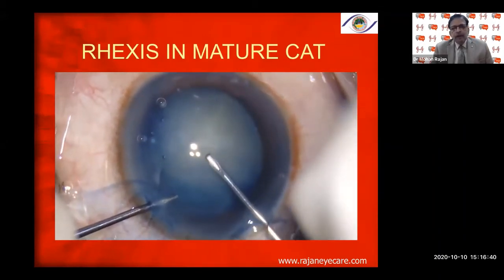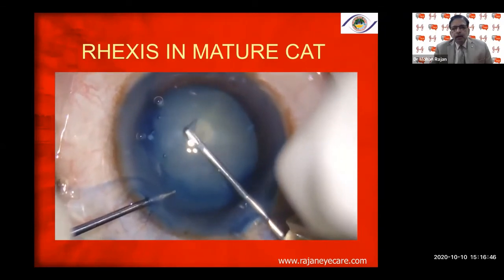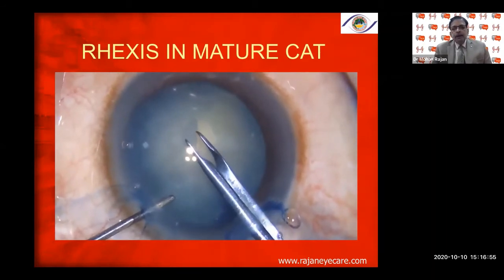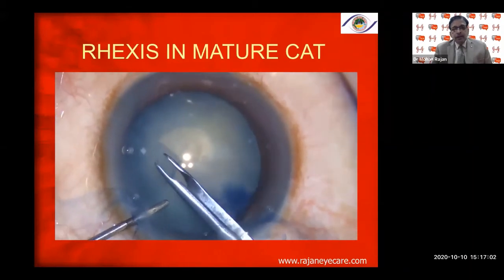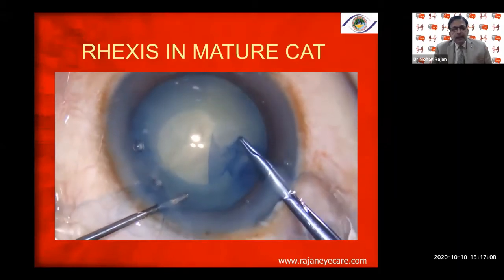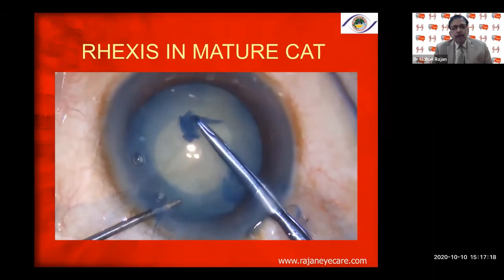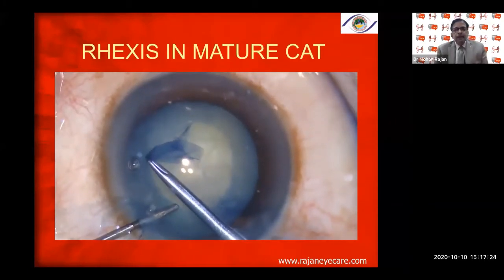In mature cataracts, always use trypan blue underneath the air bubble, then make a nice guide flap, inject viscoelastic — don't fail to inject viscoelastic — and then proceed with the capsular rhexis forceps. The capsular rhexis forceps gives better control of both size and shape of the rhexis in white cataracts. Re-grasp every three clock hours, catching the base of the capsular flap, and conclude the tear from outside in, keeping the anterior chamber deep throughout.